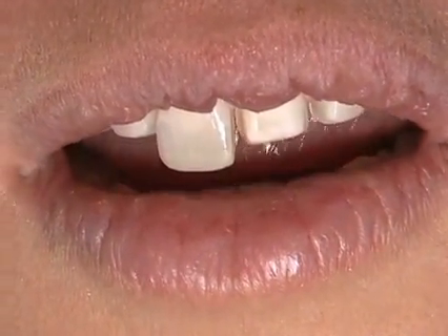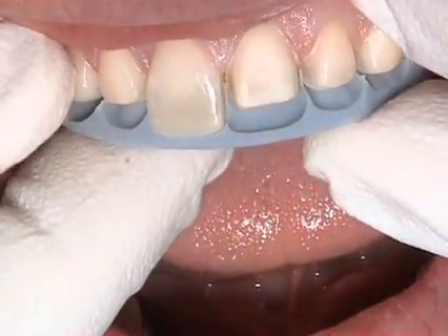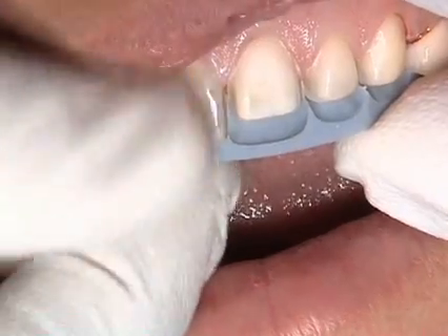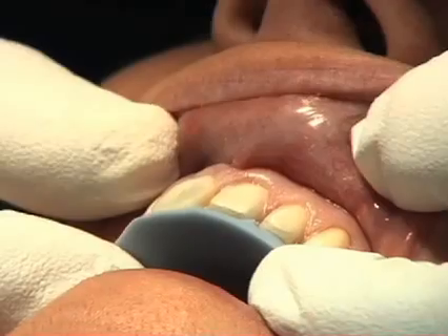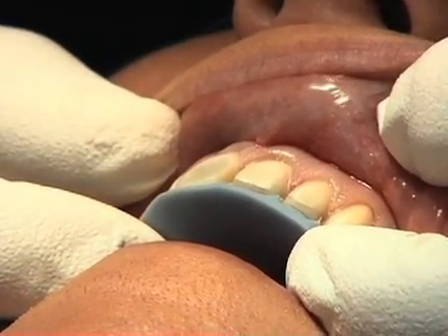In addition, you can use silicone indexes made from the initial situation, meaning that it was made with composite bonded on the incisal edge. You can see now that we have reduction, or space, for the ceramic.